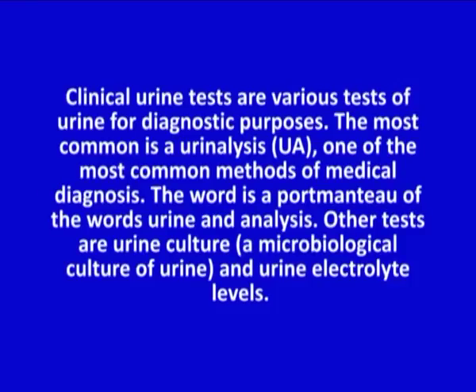Clinical urine tests are various tests of urine for diagnostic purposes. The most common is urinalysis, one of the most common methods of medical diagnosis. The word is a portmanteau of the words urine and analysis. Other tests are urine culture, a microbiological culture of urine, and urine electrolyte levels.